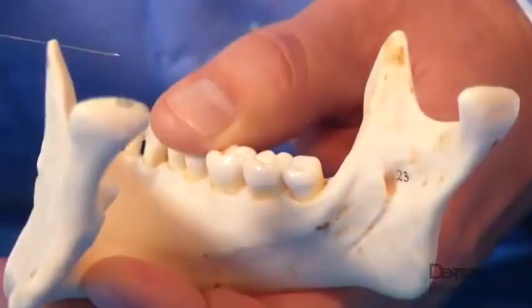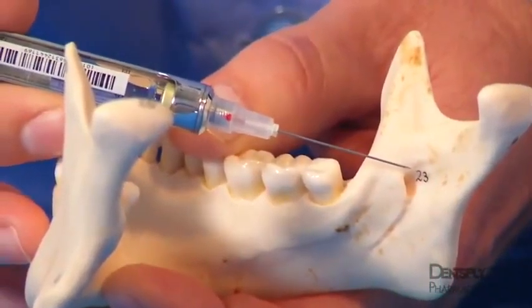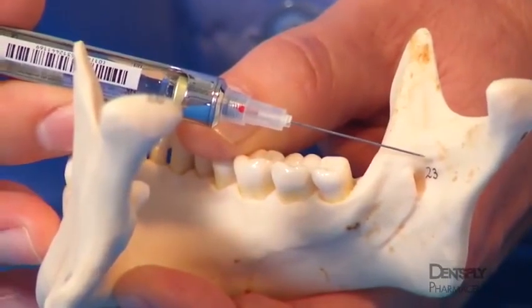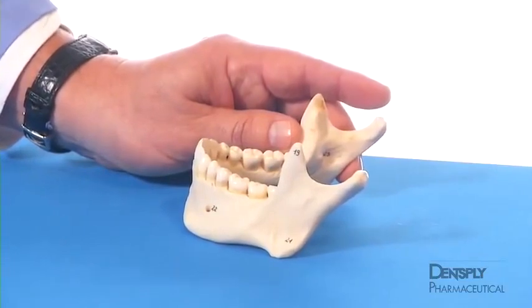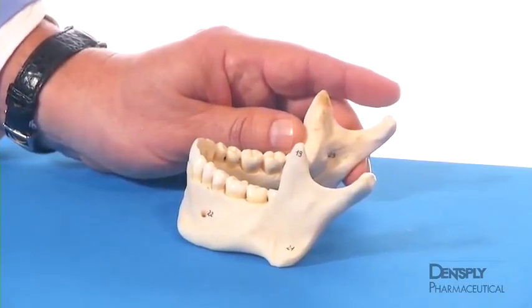Deposition of anesthetic in this region will bathe the inferior alveolar nerve just before it enters the mandibular foramen. Intraoral landmarks are key to this injection technique. The height of the injection is established by the greatest depression of the ascending ramus, the coronoid notch, a concavity on the anterior lateral border of the ramus.